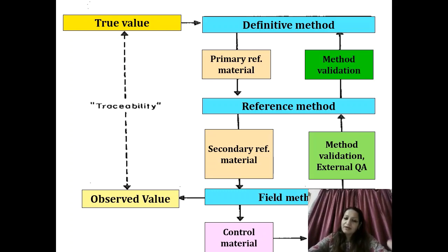So calibrators which we are working with at the baseline level in the lab must be accompanied by a traceability certificate that ensures that the value provided by our working calibrator is in fact in sync with the value provided by the highest order calibrator. Then only can we, with great surety, report the unknown patient test values against our calibrator. Nowadays, like I said, this is being extended to the internal quality control materials also, which are coming with a traceability certificate, which are following the accuracy testing just like the reference materials. So that day has also come into vogue.